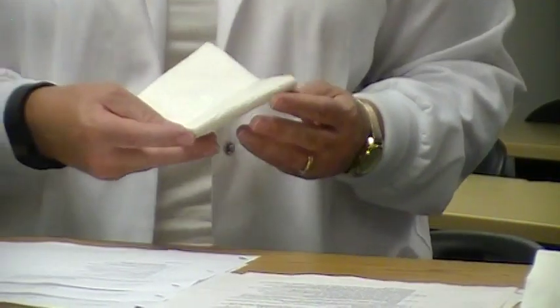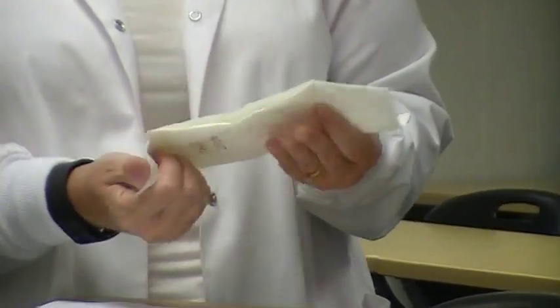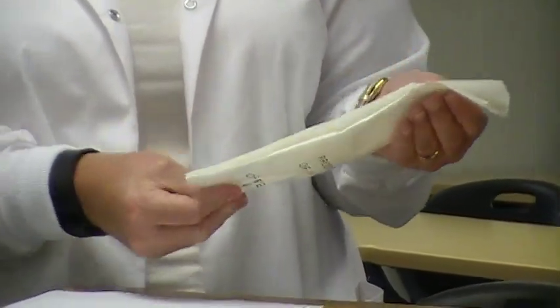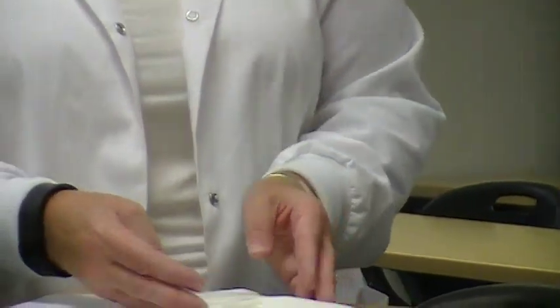So, I'm going to move to the side. I'm going to open my package. And again, the outside of the package is not considered sterile. The only part that is going to be sterile is the inside where the gloves are located. Sometimes with the equipment that you're going to use in school for checkoff, you just have to work with it a little bit because it's been in there for quite some time.